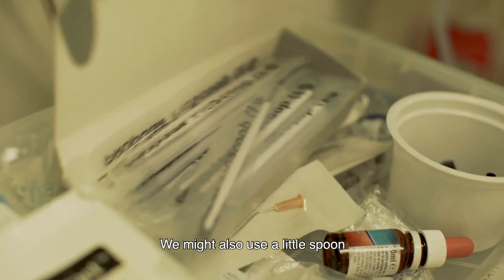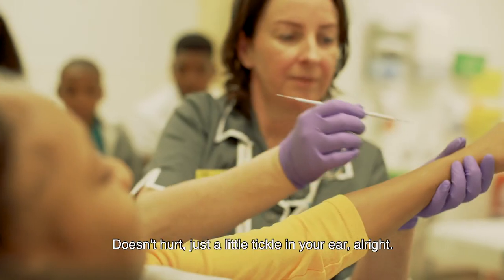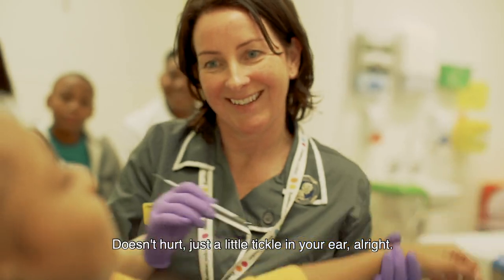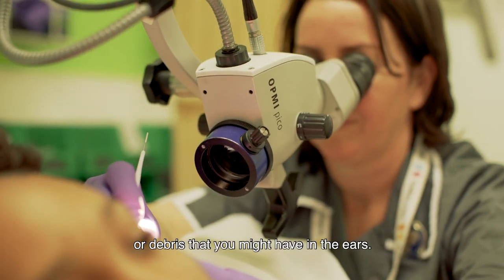We might also use a little spoon that was made specially for the ears. It doesn't hurt, just a little tickle in your ear. This just tickles out a little bit of wax or debris that you might have in the ears.